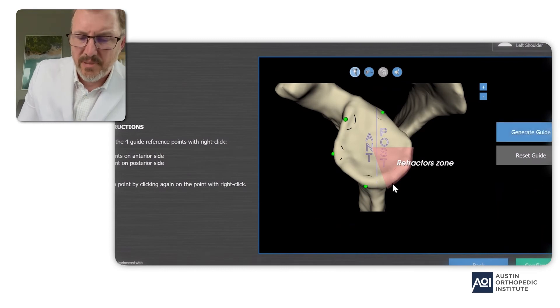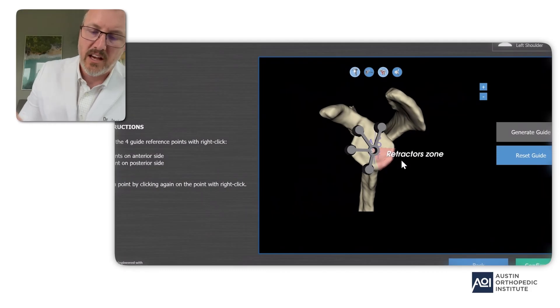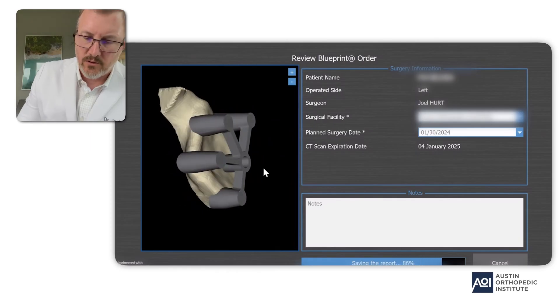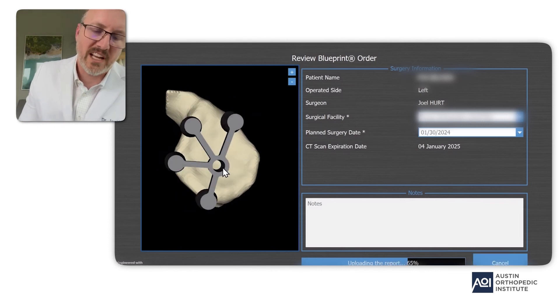What you're seeing here is the end of the socket. I picked four points and pressed 'generate guide,' which creates a model for a guide that will be three-dimensionally printed in real life. We'll set it on top of the glenoid, use that little hole to drive a pin through it, and everything else will be based off of that. I confirm I like the scan, then save the report and send it. I'll receive a socket and a corresponding guide that is specific to this particular patient. I try to do this two to three weeks beforehand so we have enough time to generate it — the company will three-dimensionally print the guide, I'll have it on the day of surgery, and we'll sterilize it because it's metal.